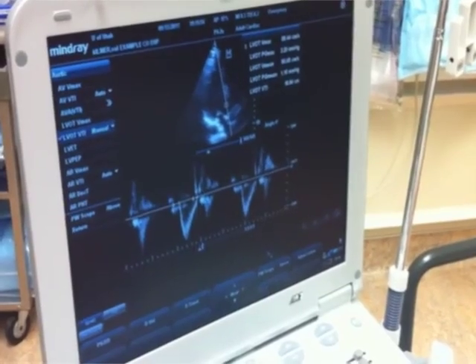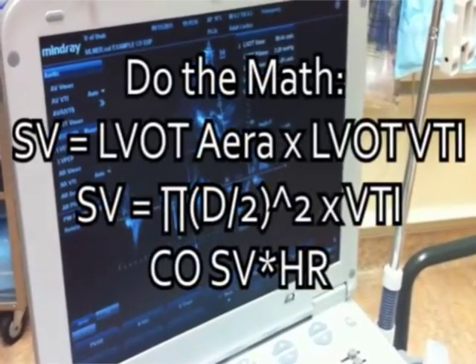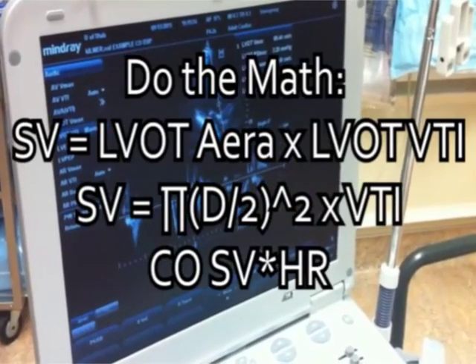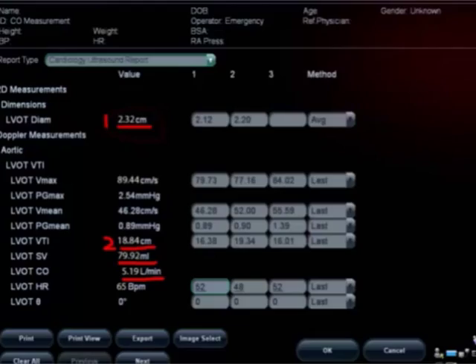Now I could just use my calculator and say the VTI is 18.84 centimeters, the LVOT diameter is 2.3 centimeters, and I could figure out my cardiac output or my stroke volume. In this case, I'm just going to hit report, and it's going to do all those measurements for me. LVOT diameter, 2.3 centimeters. LVOT VTI 18.84, which gives me a stroke volume of 79.92 mils. And voila, there's your stroke volume. Multiply that by 65 and you've got your cardiac output.